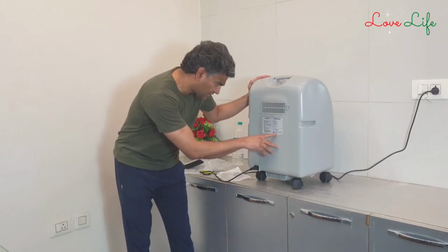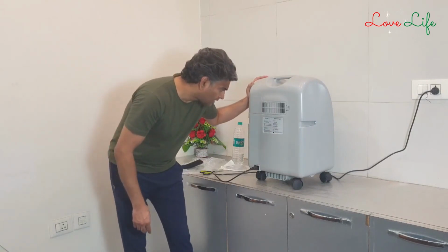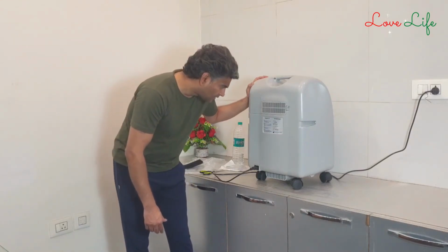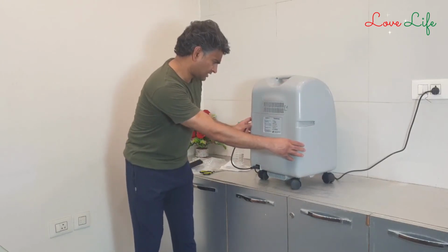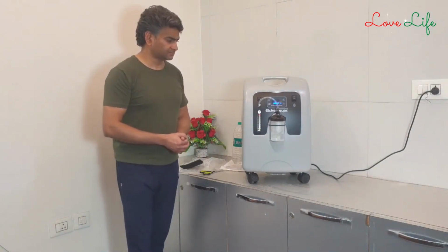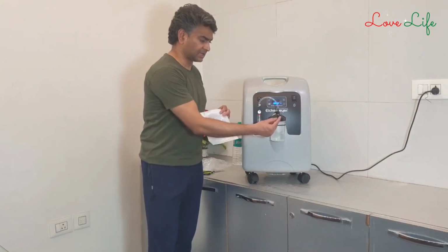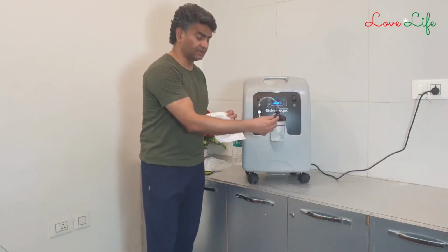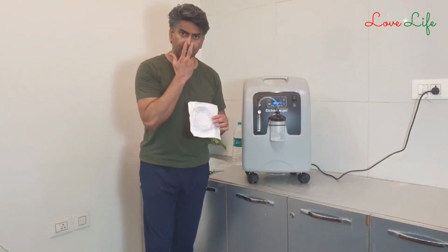And you see this device is manufactured in Germany. And this is for medical use. And it works in 220 volt. And the rest, I think, is not important. So let me turn it on again. This nasal cannula has to be connected here. You need to plug the cannula here. The one end of the cannula here, and the second end has to go here in the nose.